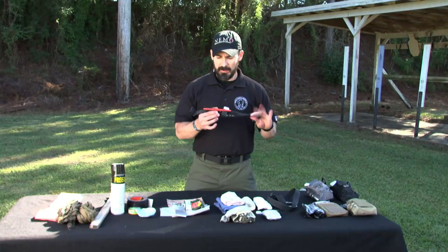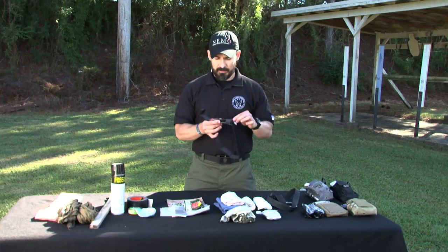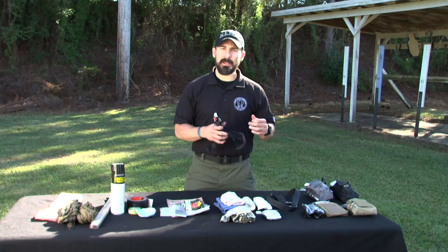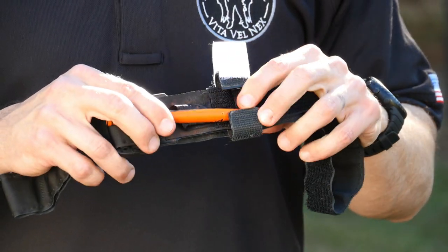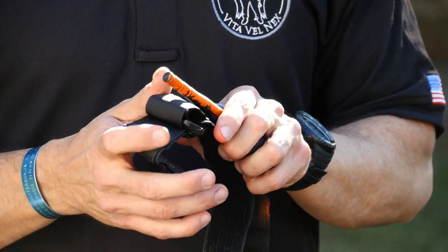One of the things we can look at is tourniquets. I've got a tourniquet here — this is a Combat Application Tourniquet. Whether you have this, a SOF-T Wide, a RATS, or any other tourniquet you utilize, as long as you're good with it, that's great. But what if you don't have this with you? What if something prevented you from having a tourniquet? What could you use from your environment?